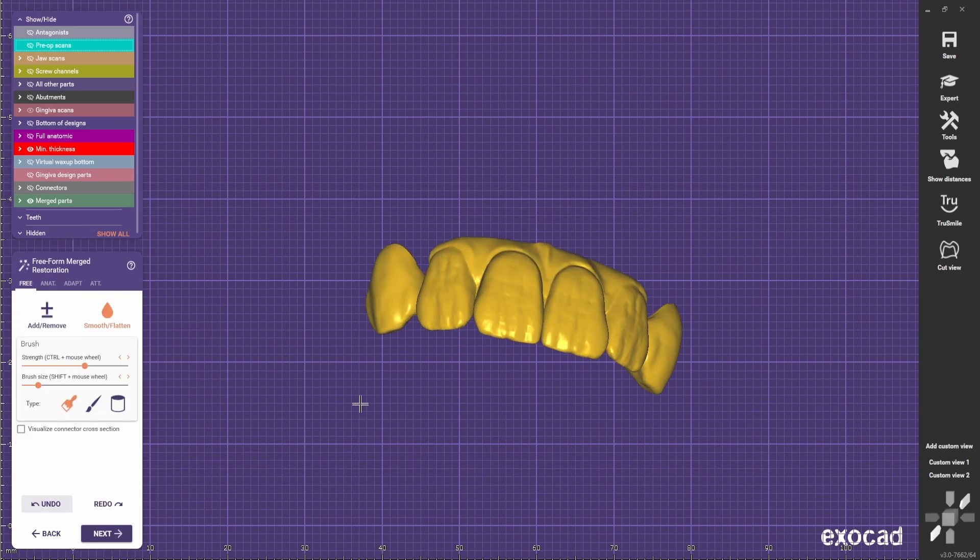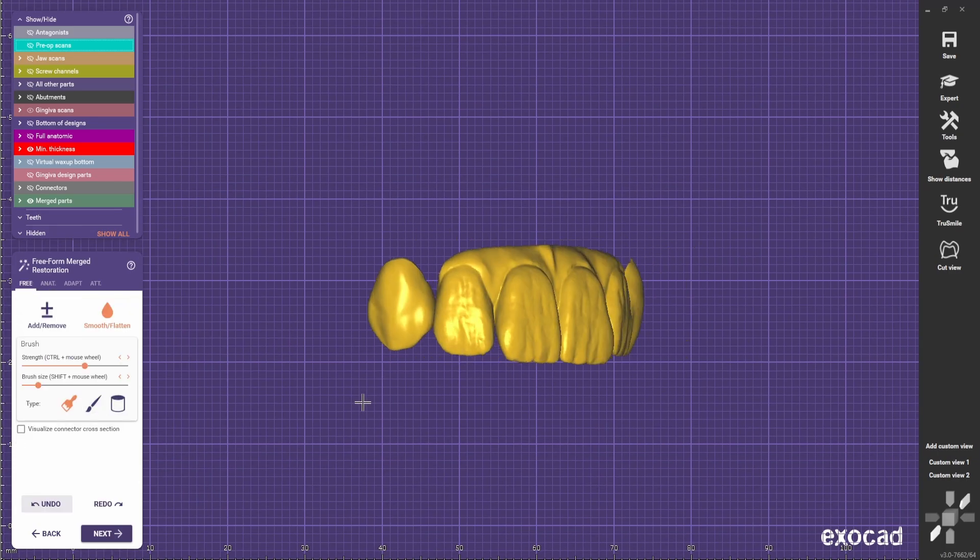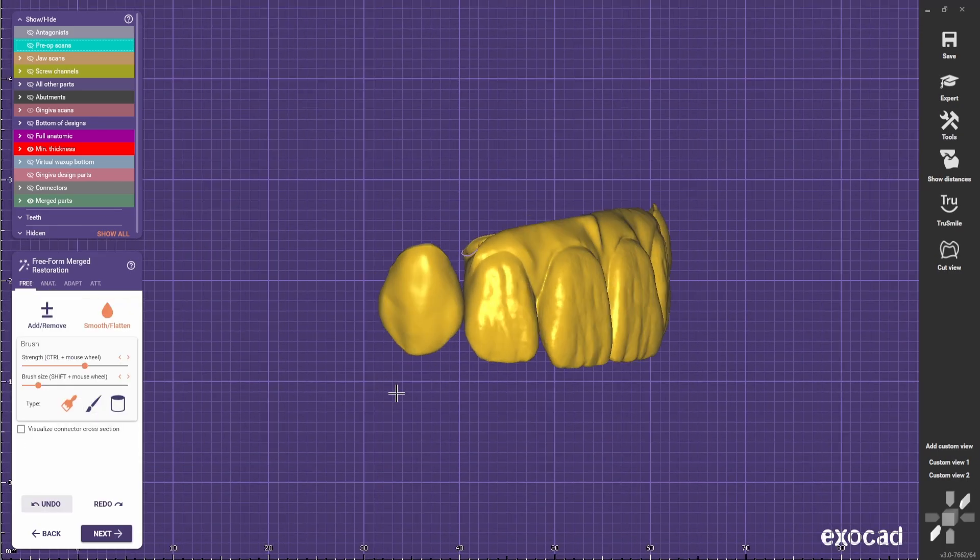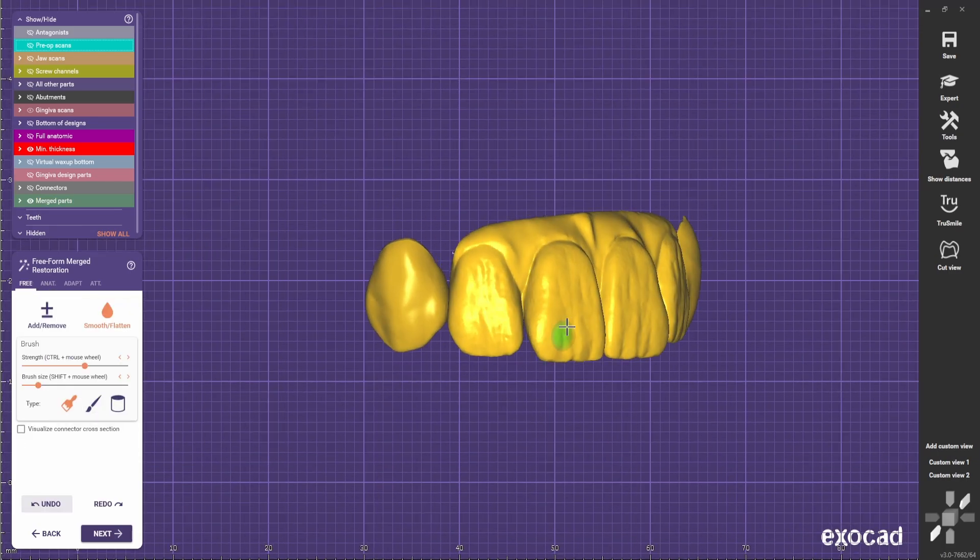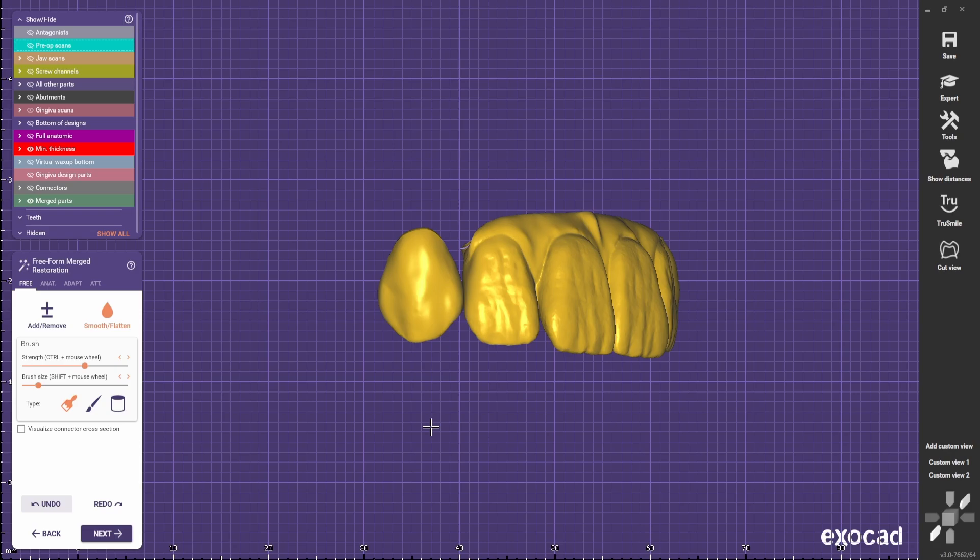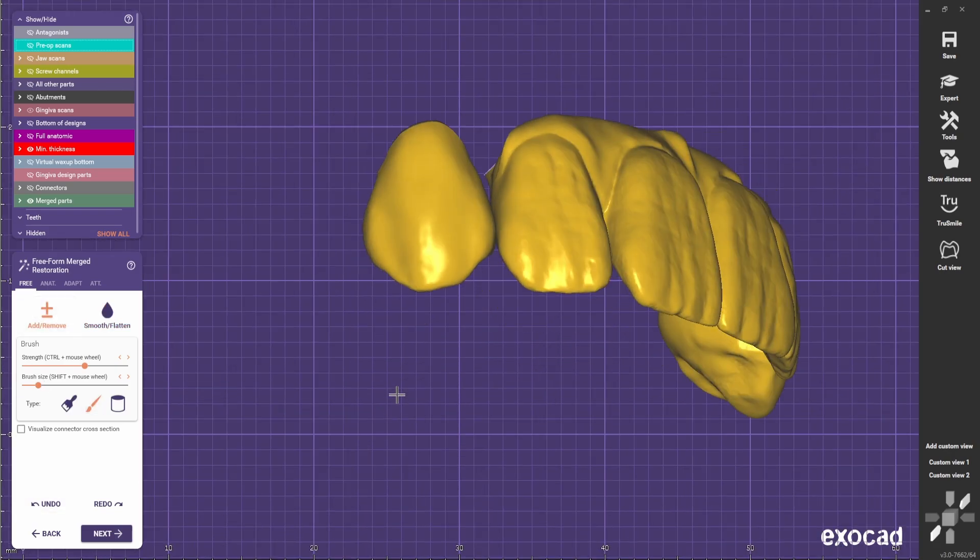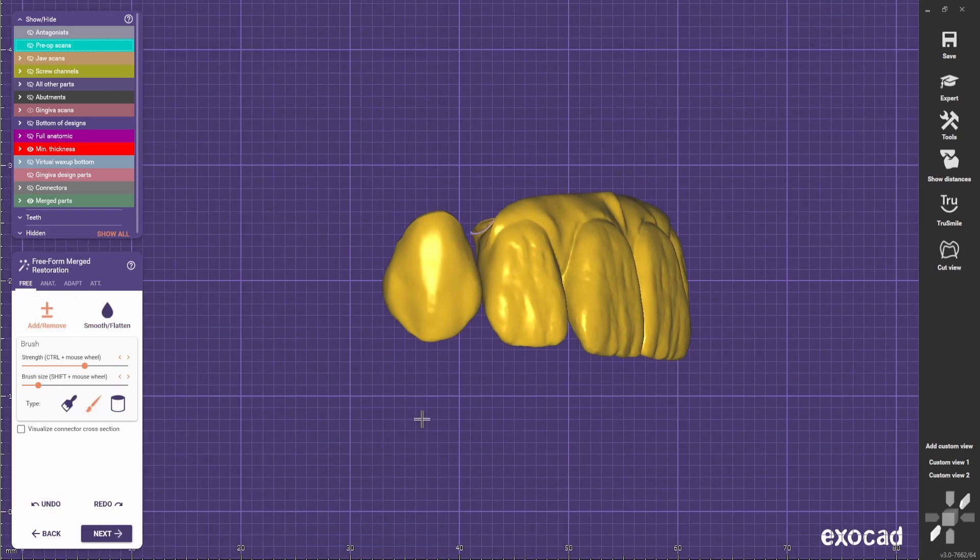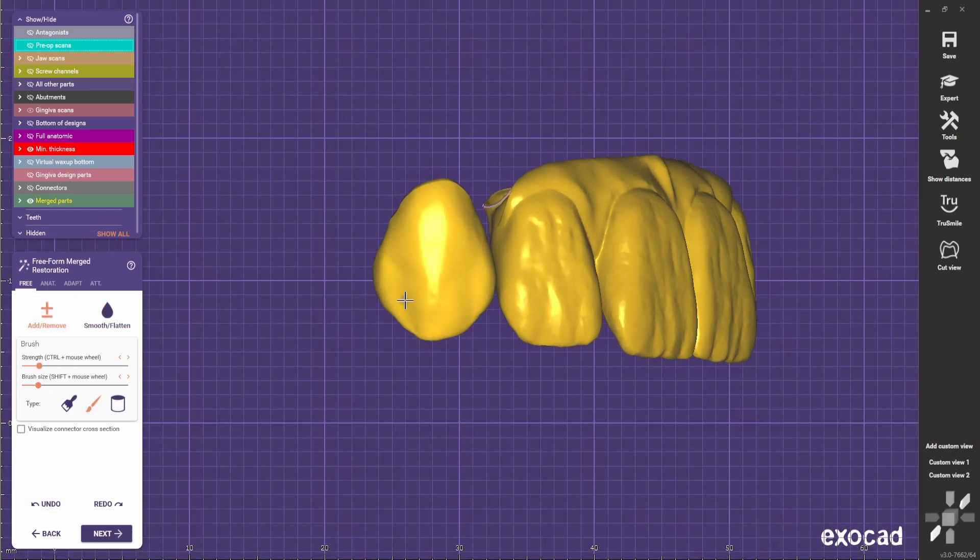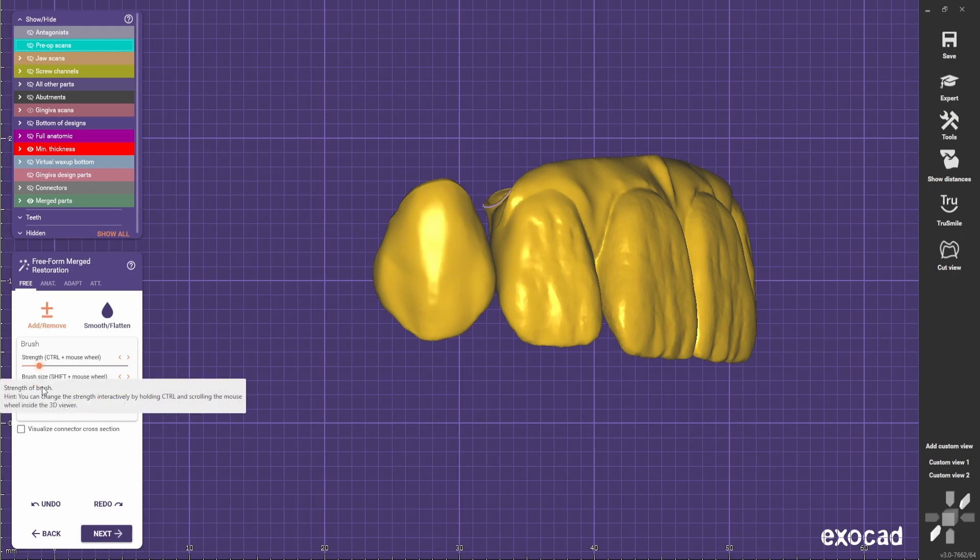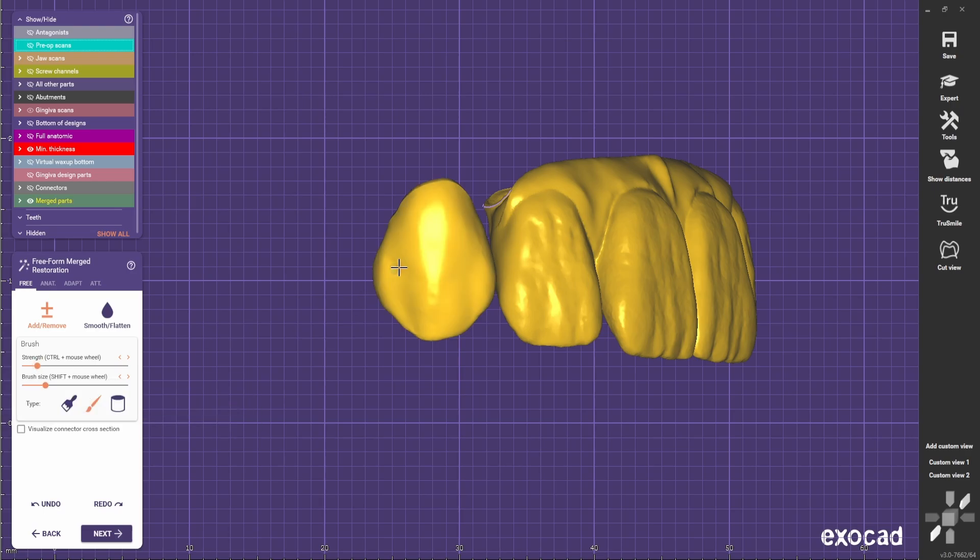I also find that the canines are a bit too smooth so I will try to do a bit of surface texture to make it more similar to the rest of the case. Usually I like to go not very strong and we're going to play around with the brush size. We're going to use the point of knife.